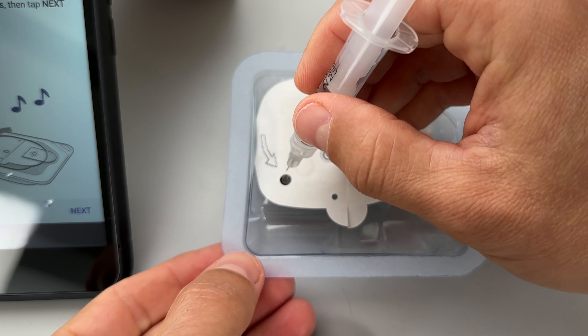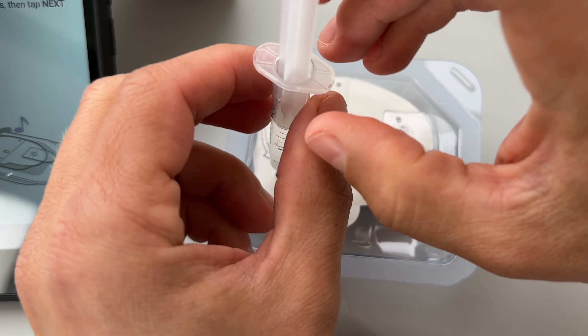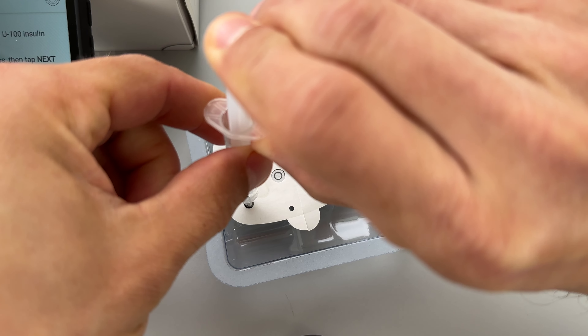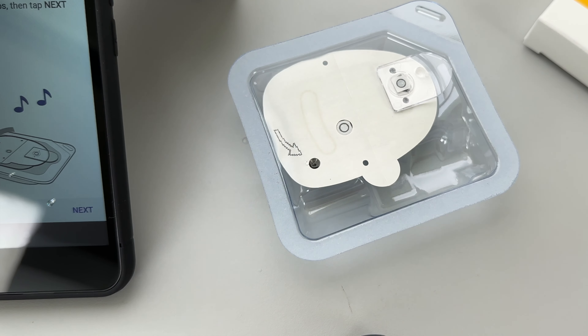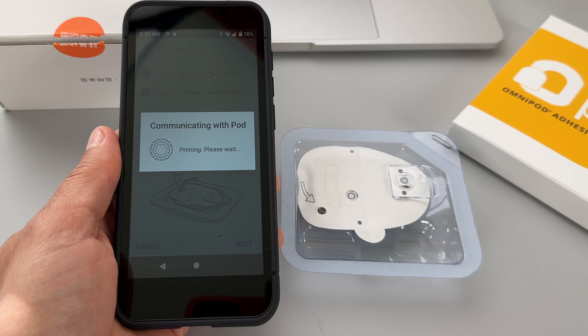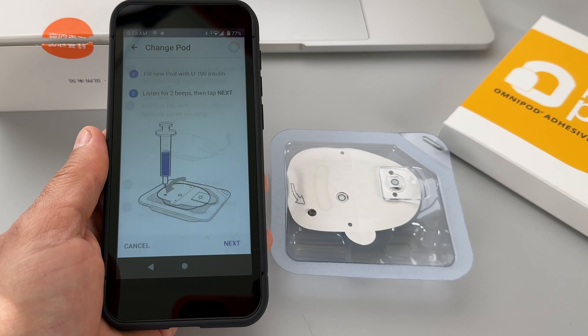I'm going to open a brand new pod package and fill it with insulin. I'll put the needle on top of the plastic cartridge, clean the insulin vial with the alcohol wipe, then pull some air into the cartridge and push it into the vial — air bubbles going in — and now we can pull the insulin into the cartridge. The needle is so short that it can come out of the vial easily as you are pulling the insulin in.